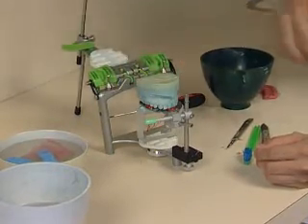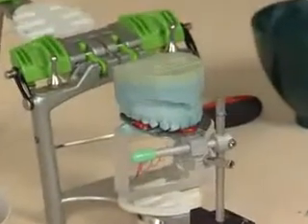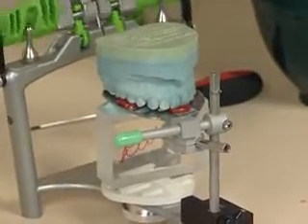Make sure it's seated in good. Feel it carefully and make sure it's seated good. And now we close the top of the articulator and see how much mounting stone we need.